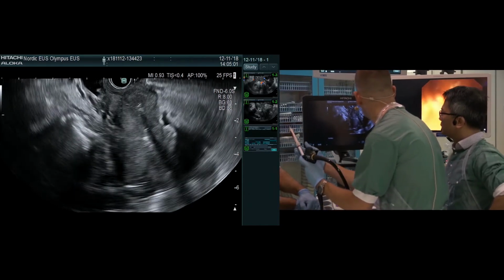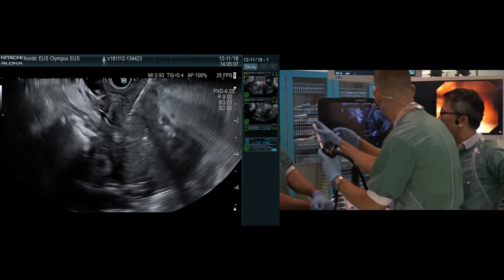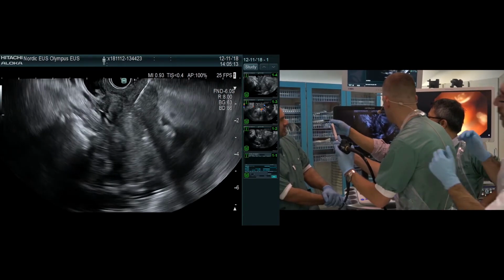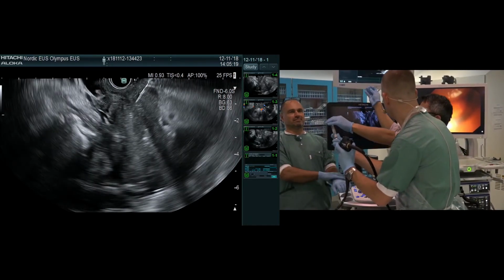Oh, that's a good position. This is a little better position. Okay. So what I do, I try to put the stylet in a little bit to get rid of any possible contamination. Now we take it out. Do you want suction or not? Yes. Okay, then I remove.